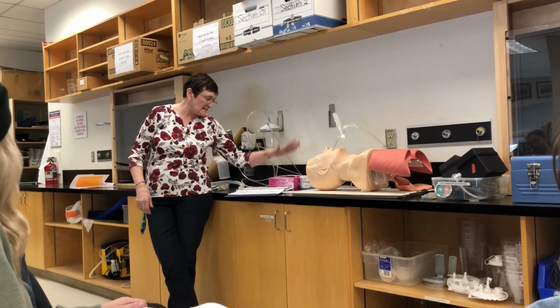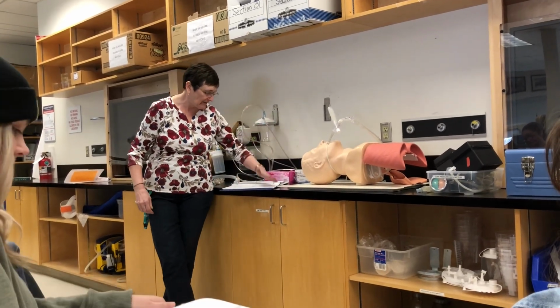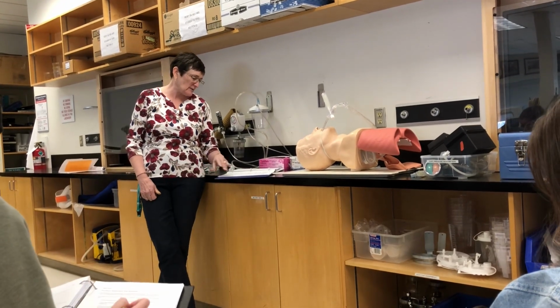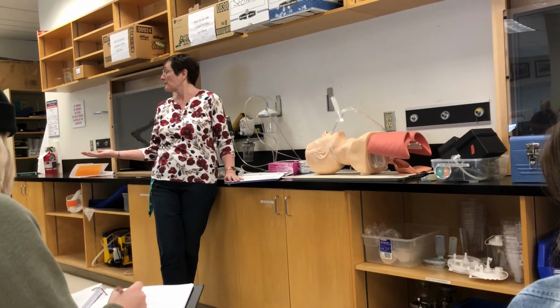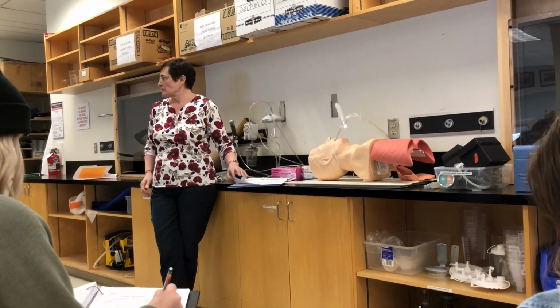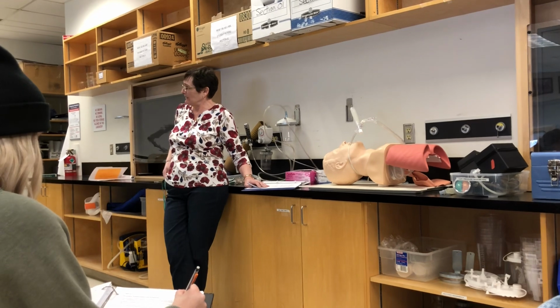So the lab itself goes through kind of what we're going to talk about in class tomorrow as well, what you're going to check before you actually extubate the patient. There has to be an order for an extubation. You can't just go around pulling endotracheal tubes out, and they don't like that.